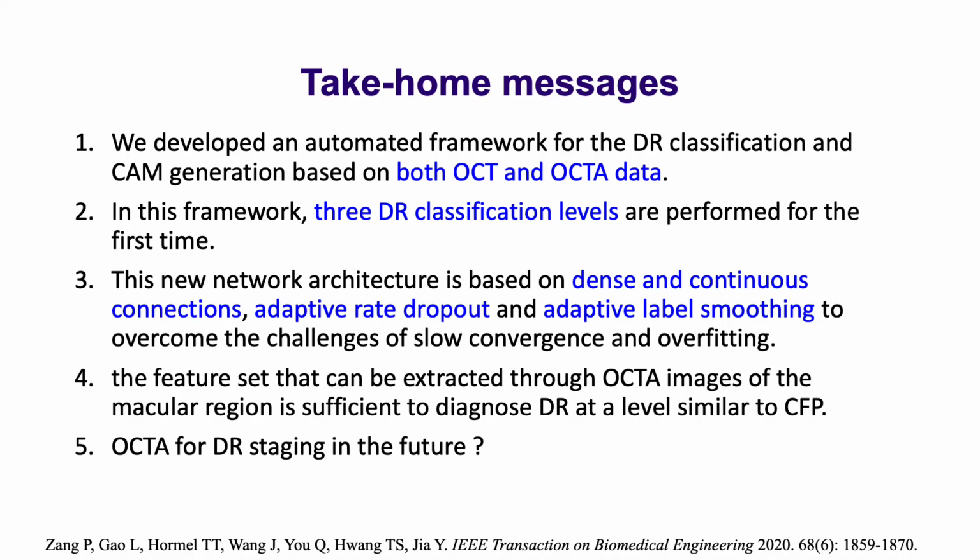Take-home message. First, we developed an automated framework for the DR classification based on both OCT and OCTA data at 3 DR classification levels. This network architecture is based on a couple of novel ideas to overcome the challenges of slow convergence and overfitting.